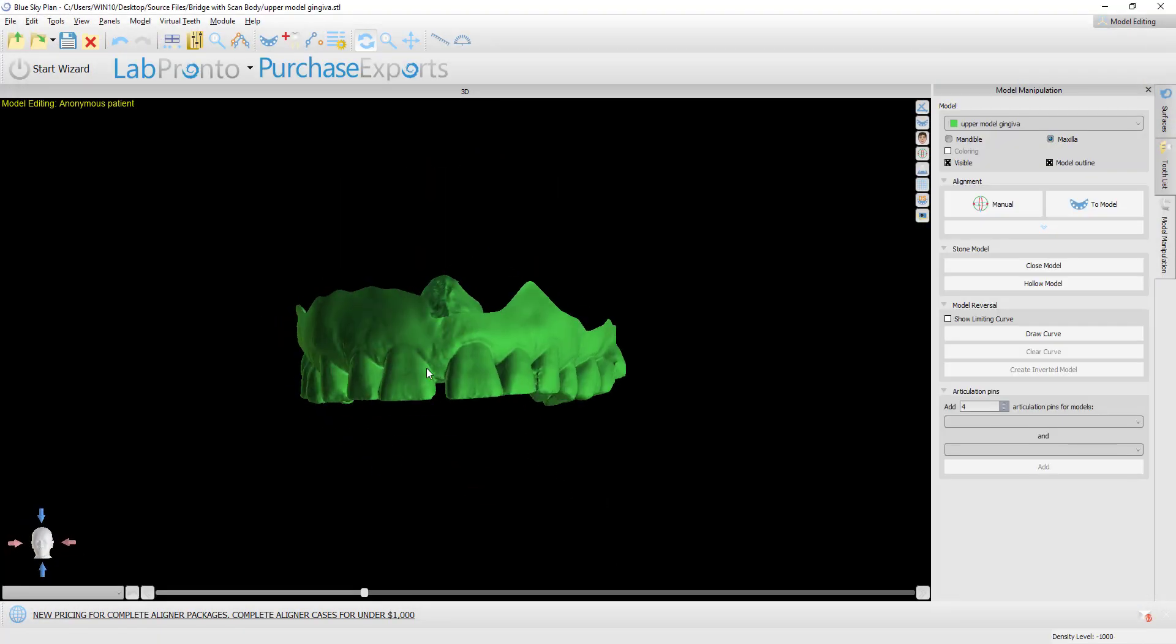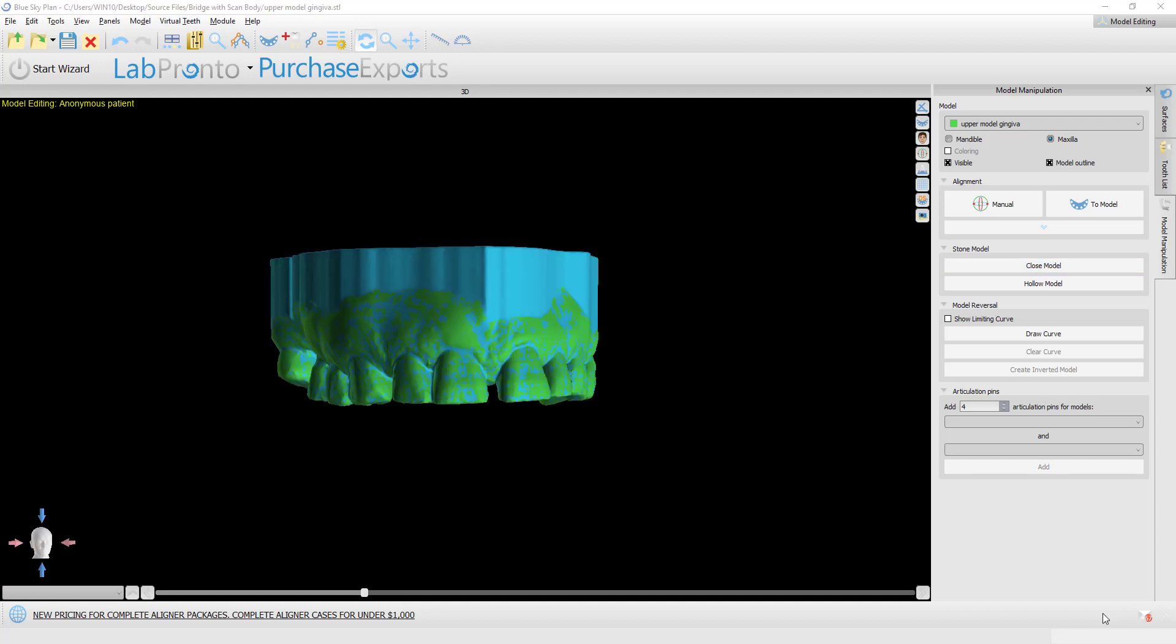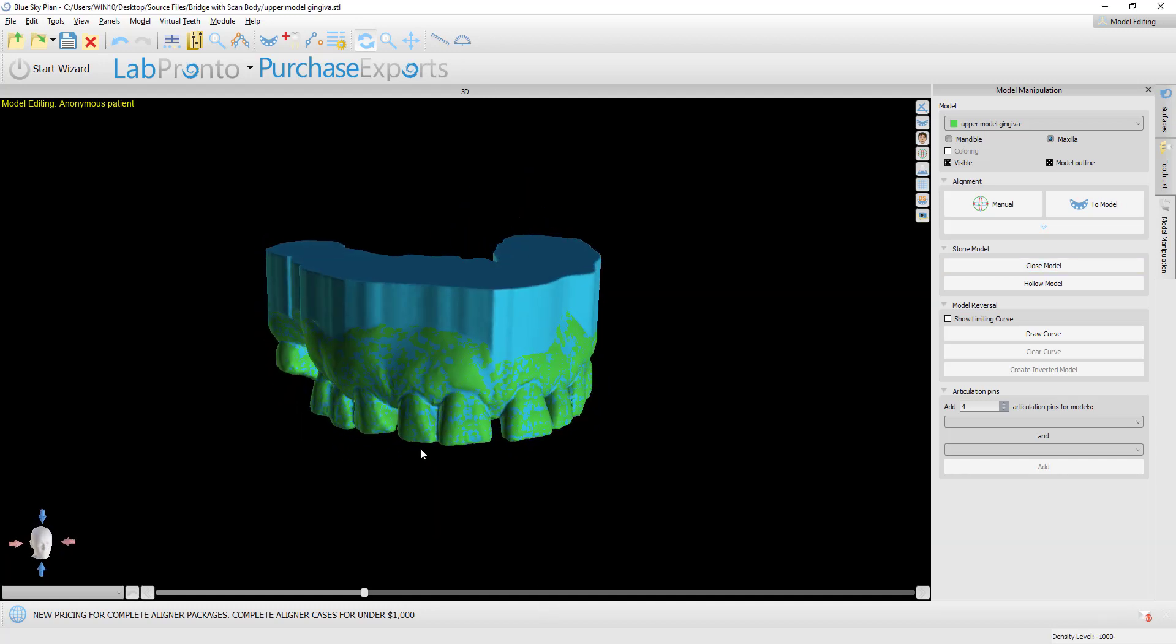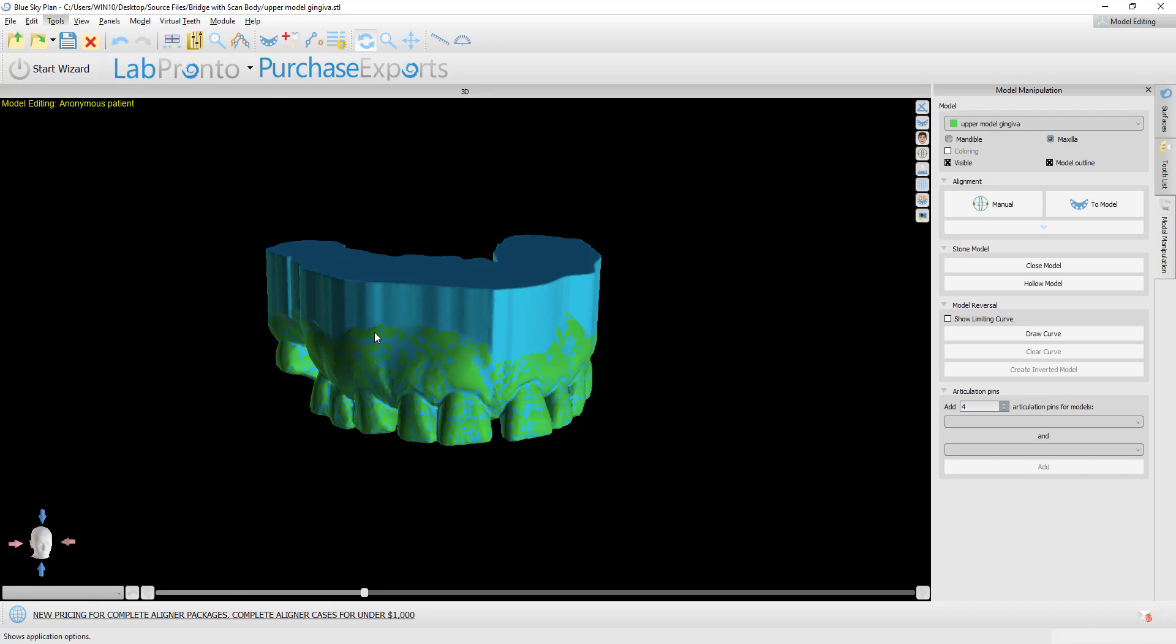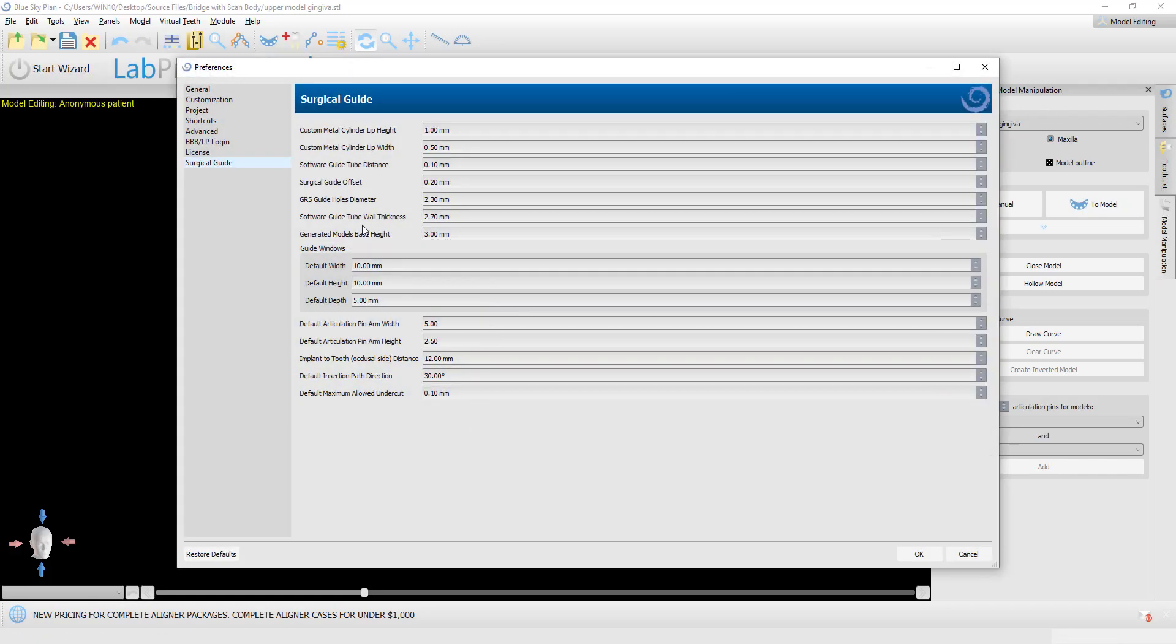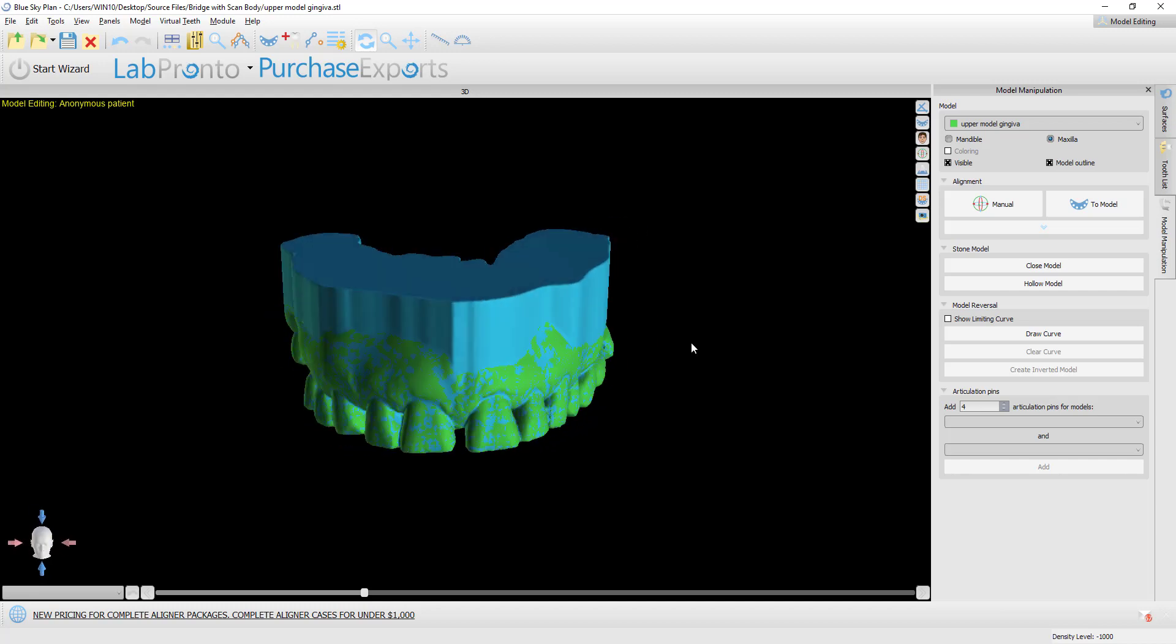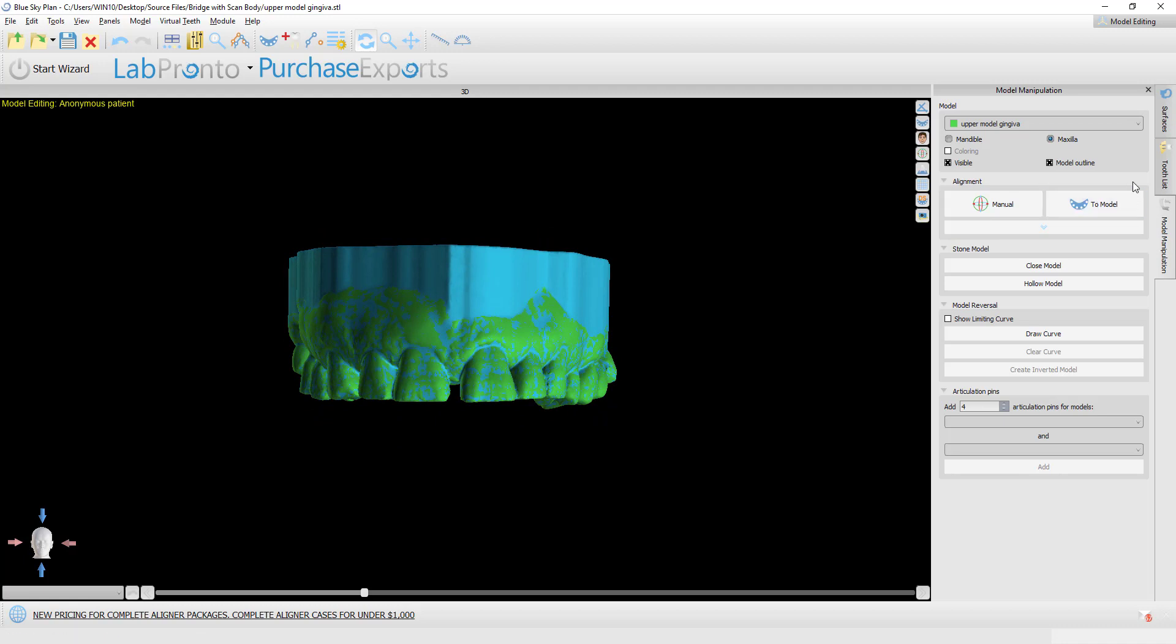Now, I'm going to click close model. We see that the model's now been closed. Just as a side point, if you want to control the height of material that's added, we can see here in preferences, surgical guide generated model base height is three millimeters, which means that it takes the lowest point or the highest point depending on the upper jaw and lower jaw to close the model, and then it adds an additional three millimeters on top of that.